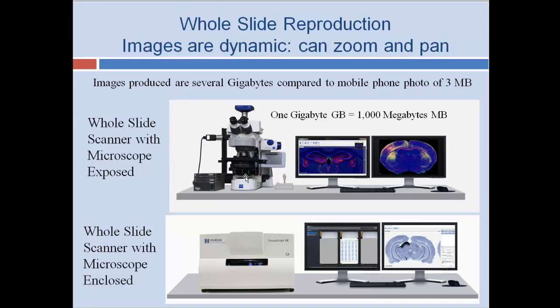And actually, a digital scan of a glass slide that has a 15 millimeter by 15 millimeter specimen on it, using a reasonably high magnification objective, can produce an image that's about 2,500 square feet. And then, how do you look at that over the internet? Well, with the software on the server and the client viewer, when the client requests a certain magnification, a certain region, then the server only sends that information.